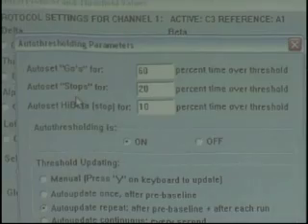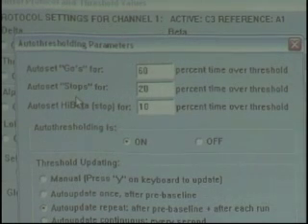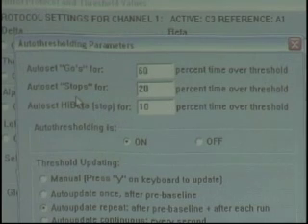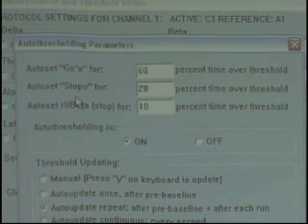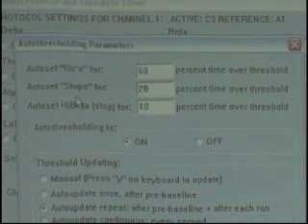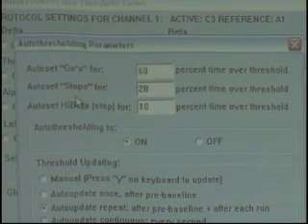Can we go over the auto set stops? Auto set stops, basically, is 20% time over threshold. Since it's a stop, we want it to be below threshold. So if it's 20% time over threshold, with this particular example, we would be meeting criteria on a stop 80% of the time. So if it's a stop, the lower the number, the easier it is; the higher the number, the harder it is.